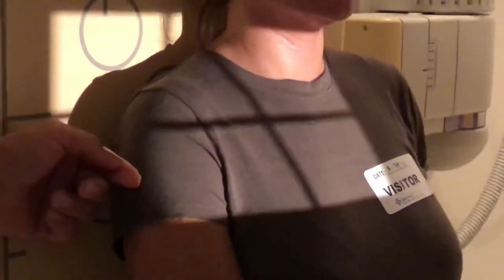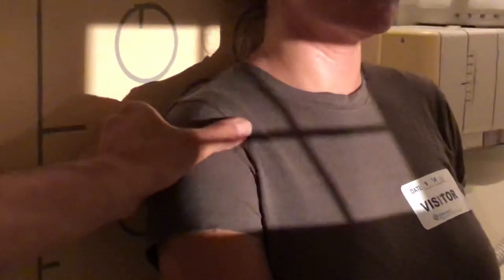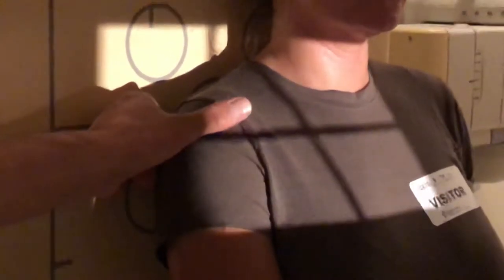We're gonna center halfway between the shoulder and the sternum, right about here. We're gonna have a little bit of light on top, light down to about mid humerus, and the position of the arm is gonna be bent across the abdomen. What this does is it gets this in a nice angle, kind of like a lateral proximal humerus. So you're gonna shoot 40 inches, shoot the x-ray centered about right there.